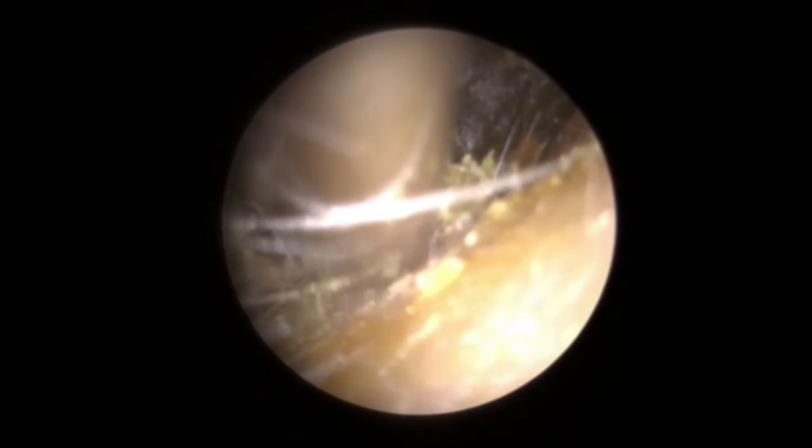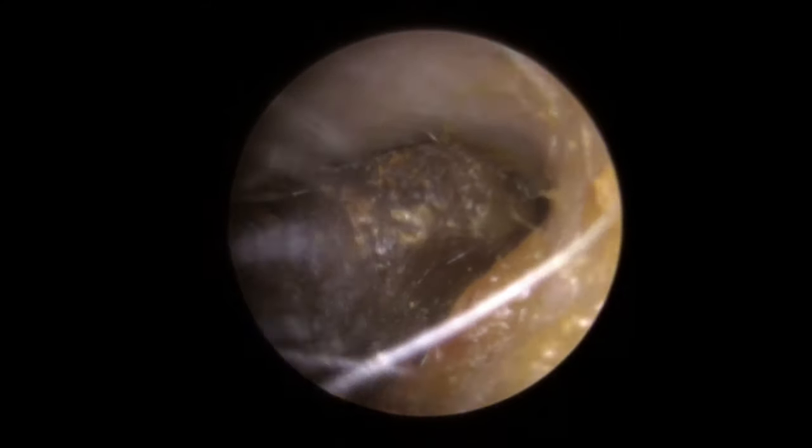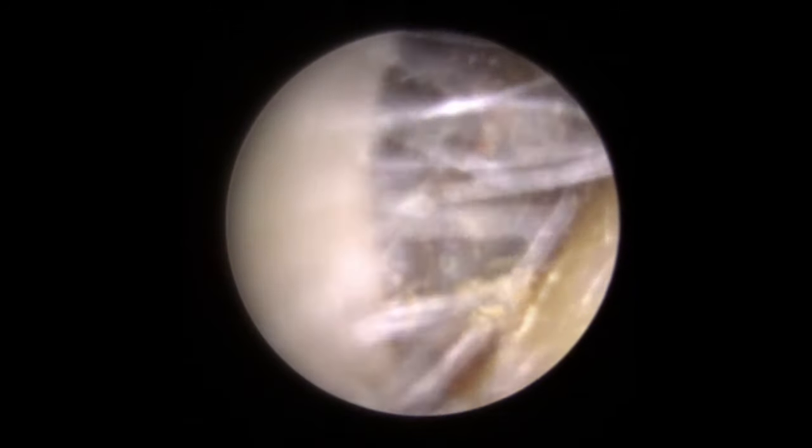I can see that the top piece of wax is much, much further back, so we need to remove a lot more of this front section before that back piece will move. So we're just going to try and bend this forwards using the Jobson horn. We've got a nice little gap there to get into. I'm going to slow everything down. As we get behind this now, we're going to start pulling this forwards — you'll see the whole big chunk of the front coming away.